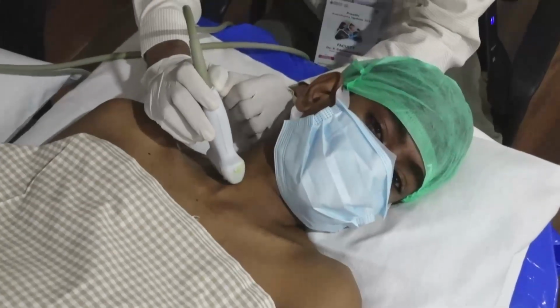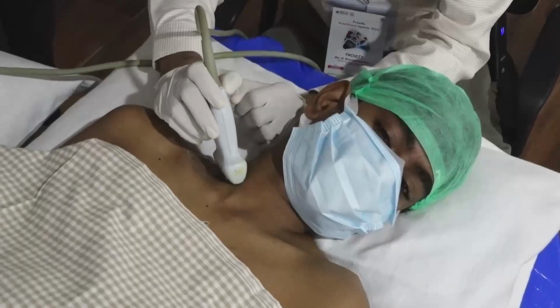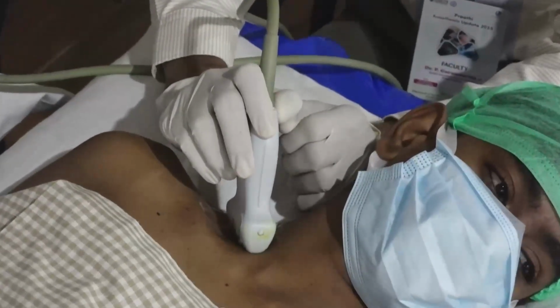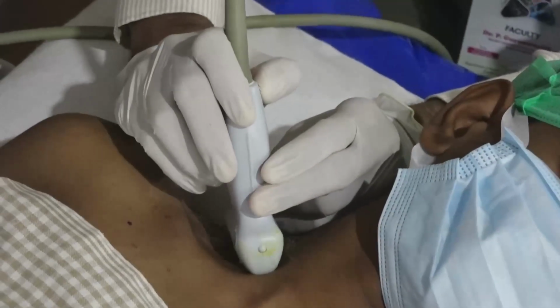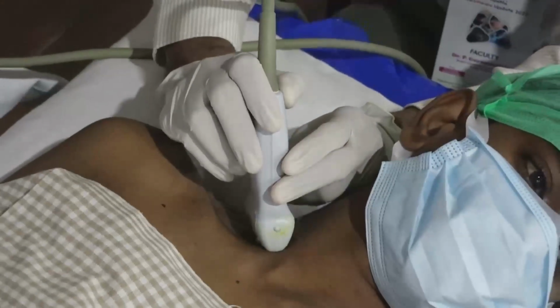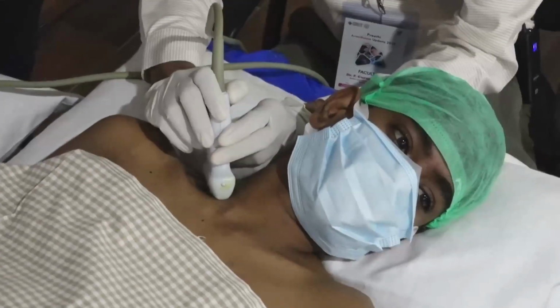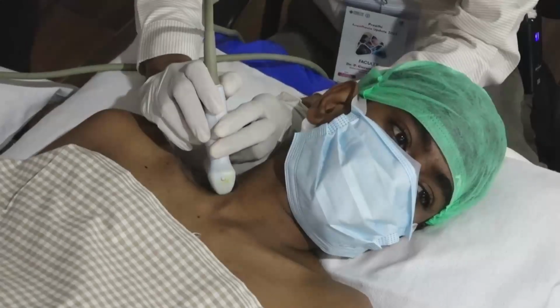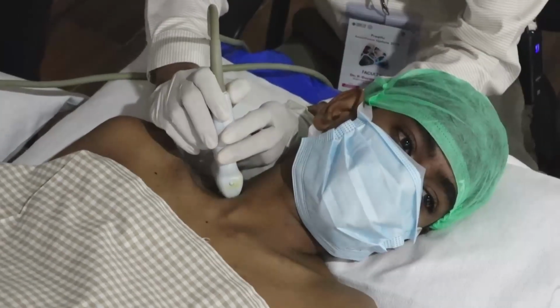Since I am keeping the probe more medially towards the midline of the neck, now I am coming laterally and again focusing on our area of interest, that is the interscalene groove between the two scalene muscles. The muscle which is medial is the anterior scalene. Next we see the brachial plexus elements.